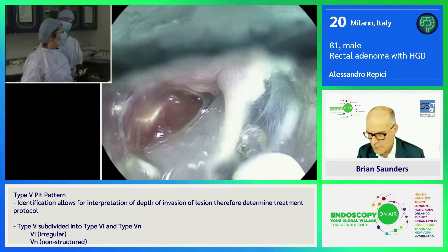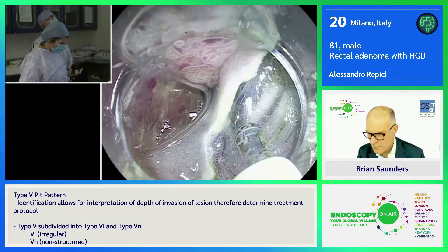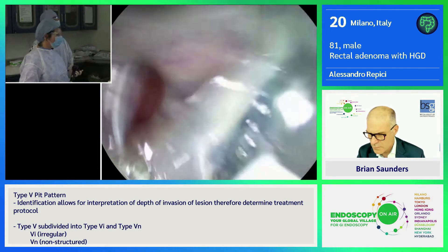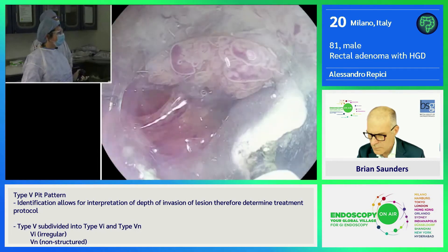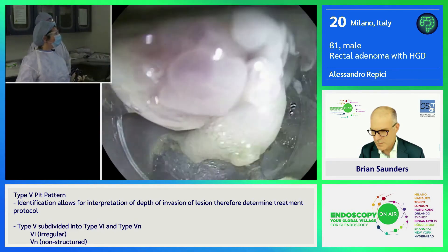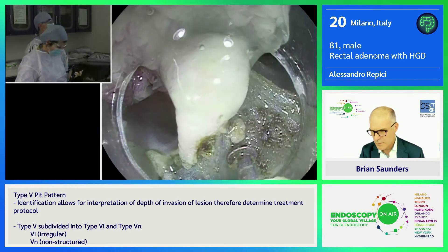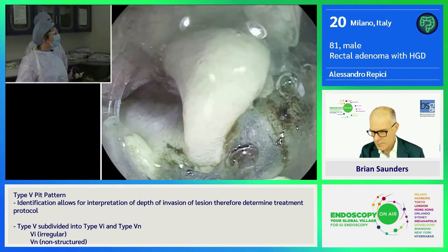Do you suggest the upper GI scope for rectal ESD? Always. The flexibility and maneuverability is really optimal. In rectal ESD it's crucial because most of the time you have very big lesions in the rectum and you need to check exactly where you are cutting. I see you just moving the scope and not touching the device at all. So you have a specific fixed distance. Yeah, I fix it at the distance I like.